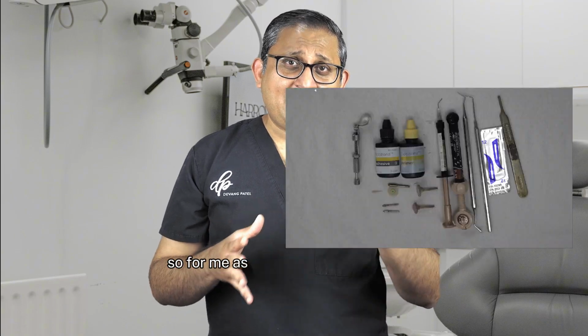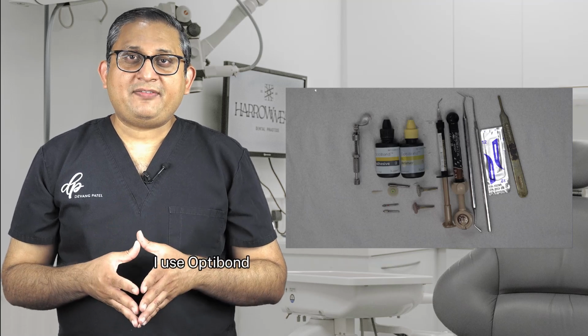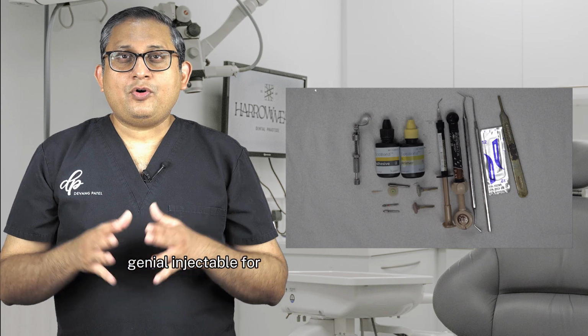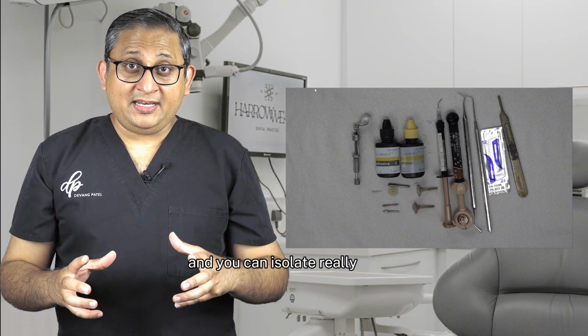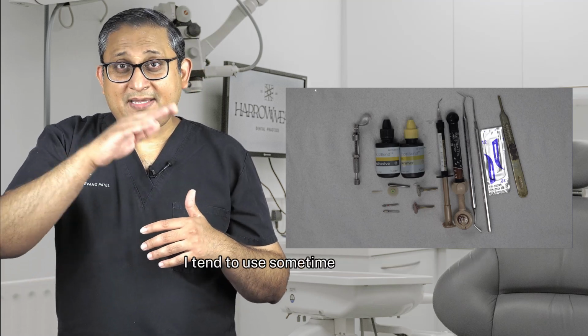So for me, as you can see in the picture, I have my Greater Curve matrix band. I use OptiBond FL for all my bonding cases. I have some polishing burrs. I use Injectable Gradia for the very tricky area in the box, or sometimes where the box is really deep and you can isolate really nicely, but you can't really see whether you're adapting well or not. I tend to use injectable sometimes.